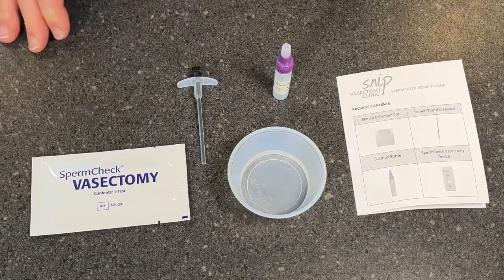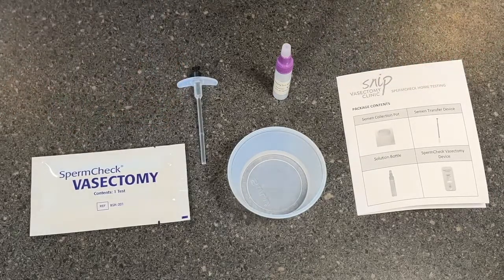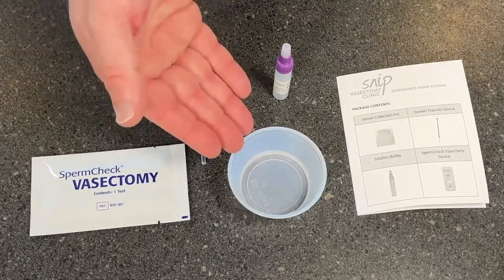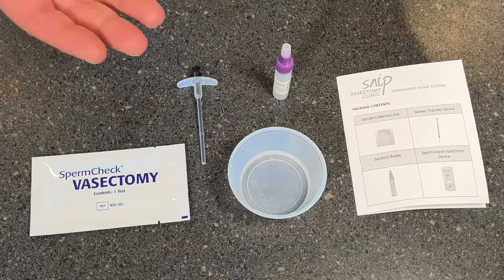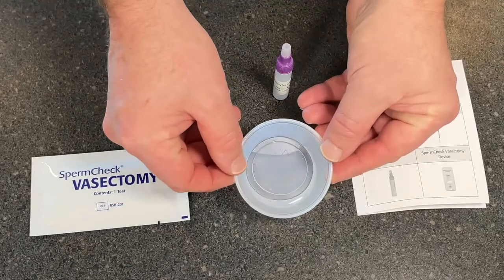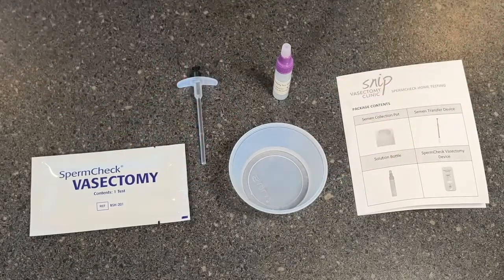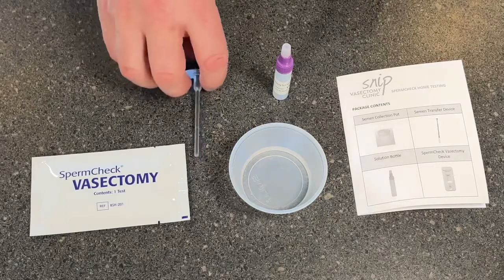The first thing to do is obviously to produce the semen. You can either do this by masturbation into the pot itself, or via sex into a condom and then pouring it into the pot. I've got some water in here for the demonstration today. Once you've produced the semen sample, you need to leave it for 20 minutes. That just allows it to liquefy and turn into a complete solution.